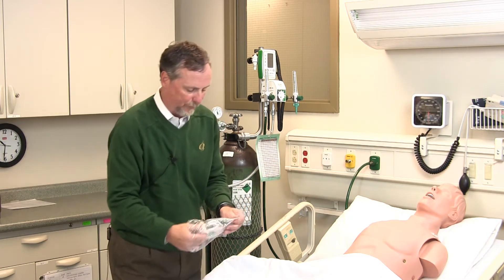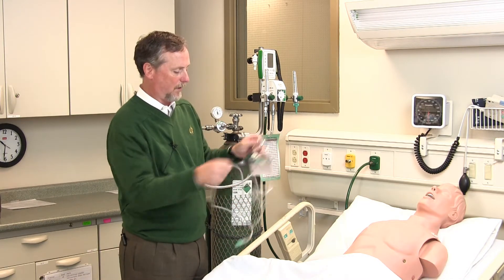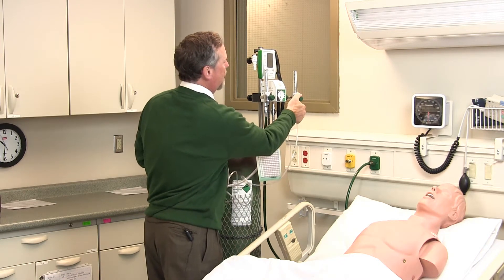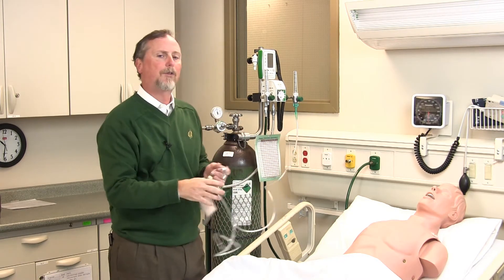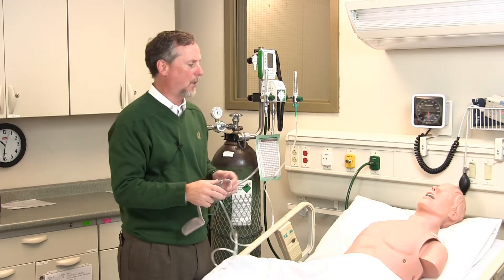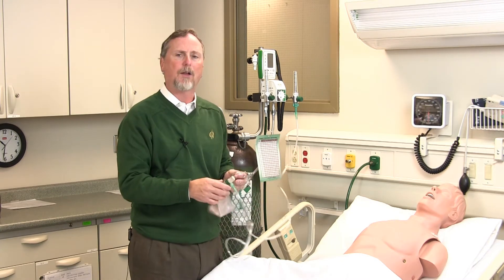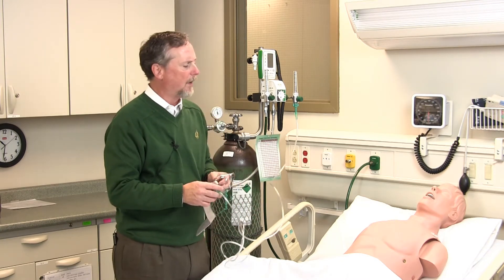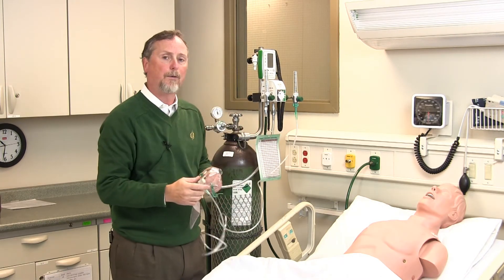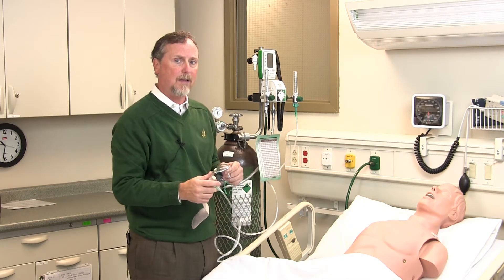We have our patient here who is in a little bit of distress. We connect our non-rebreather up to the flow meter. Where to start therapy, and what FiO2? Well, what FiO2 is the patient requiring? So presumably, maybe we're in the ER and you already have a baseline knowledge of what this patient requires. We'll say the patient's requiring 40% oxygen, so we'll dial up the dial to 40%, and this is the actual oxygen percentage, not the Heliox percentage.